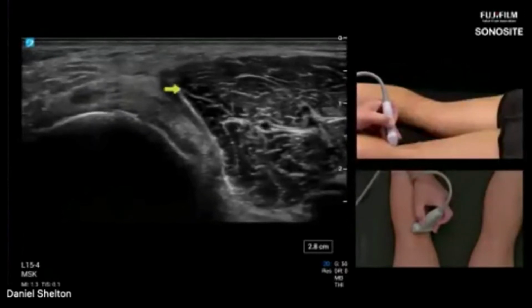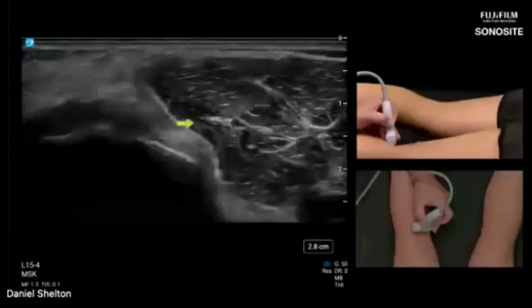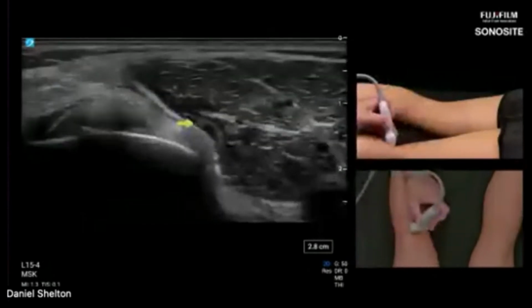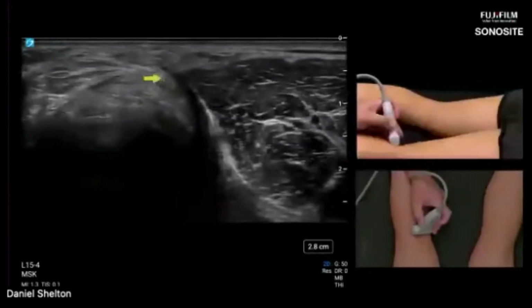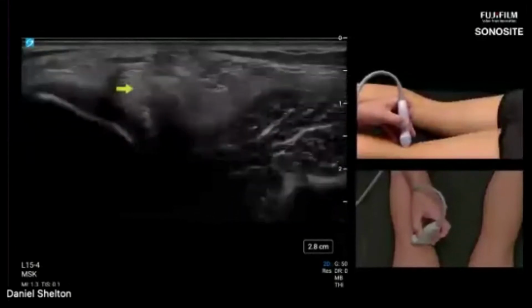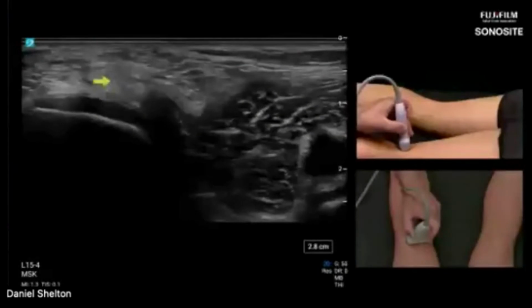And notice how the medial head of the gastroc tendon is starting to get really dark. Like I said, they're kind of shaped like a scissor, right? So you're going to get one to look good and the other is going to look bad. Very rarely will you get them both to look really good. So now let's go chase that semimembranosus tendon proximally, right where my arrow is. Here we are over the medial femoral condyle. And now here is the not Baker cyst.